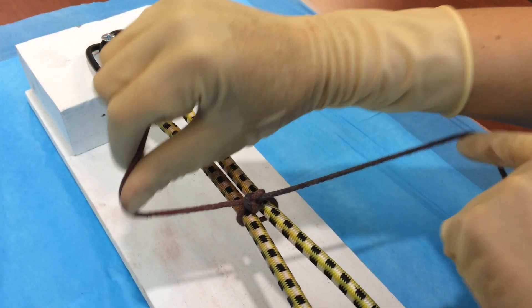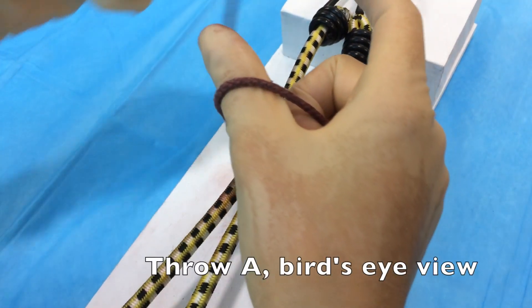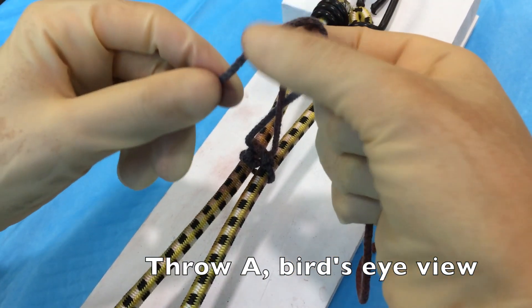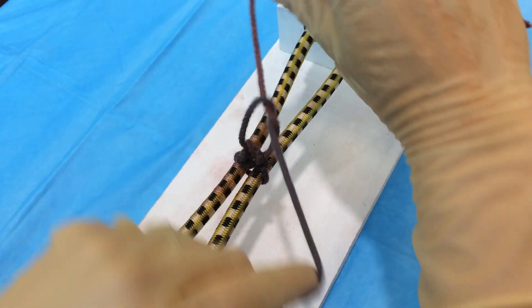Let's take a look at this one more time, this time from a bird's eye perspective. I'll take that strand in my left hand, cross it in front of my thumb, make my bird's beak and pass it through the loop, grab the free strand and push it through and retrieve it with my left hand, crossing my hands to make the knot lie flat.